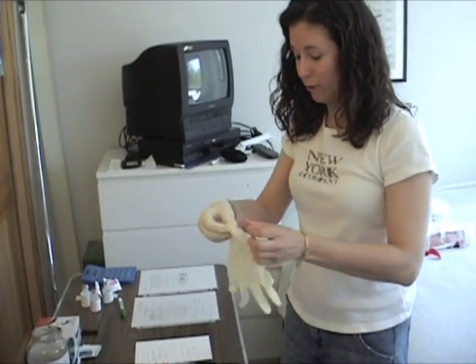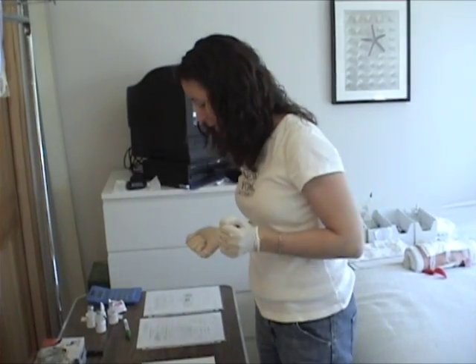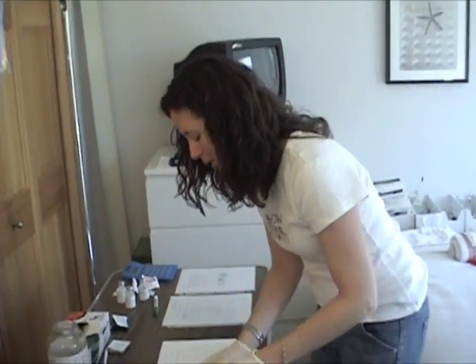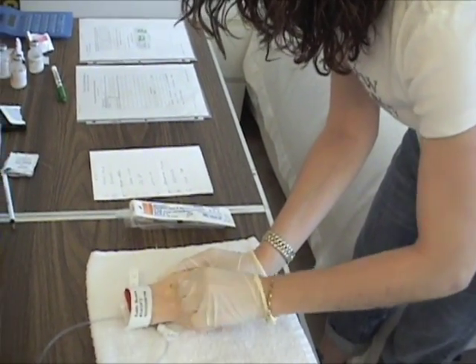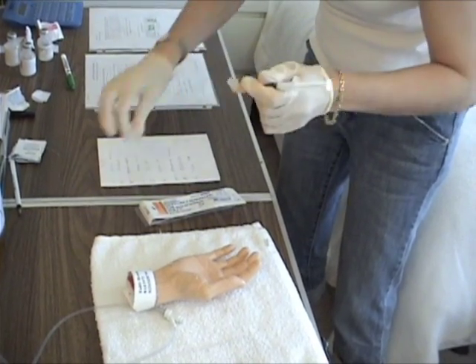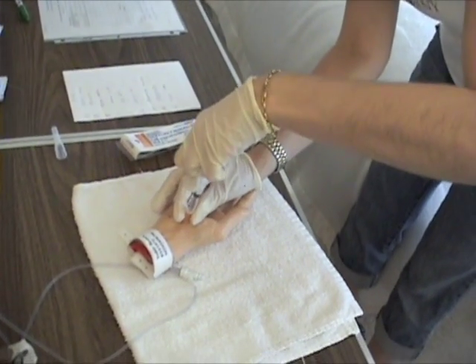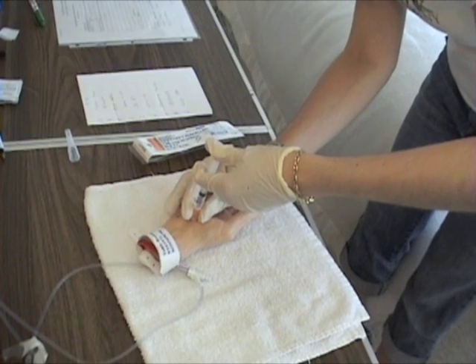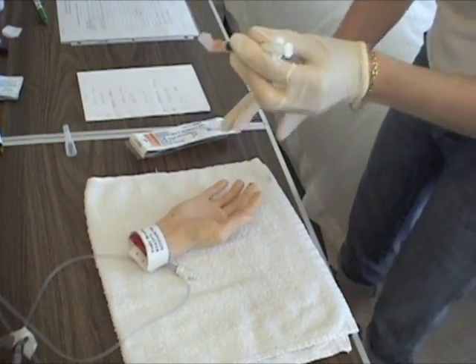Now remember, I don't have a model, so I'm going to use my hand and I give a deep IM injection to a hand. We're gonna clean the sides. So always from the middle, circular towards the outside. Okay. Grab my needle. This I'm gonna tense, 90 degrees, go in, make sure you aspirate, and then go in slowly but surely with the medication. Okay, that's it for that.